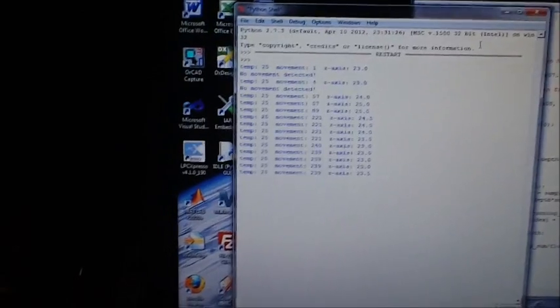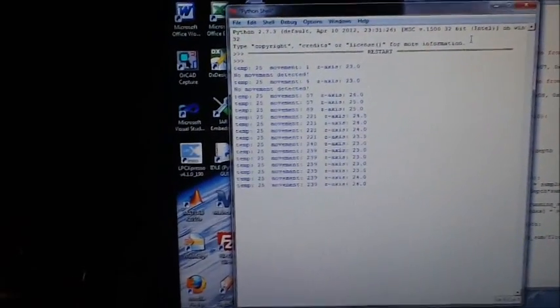The baby monitor will send a signal to the PC about once a second. That signal will include information about recent movement, the orientation of the baby — whether it's on its back or its belly — and the temperature.